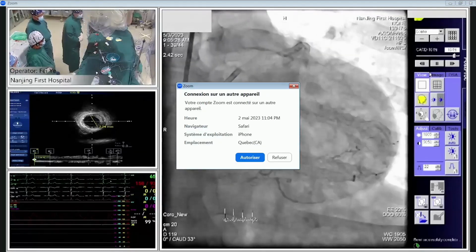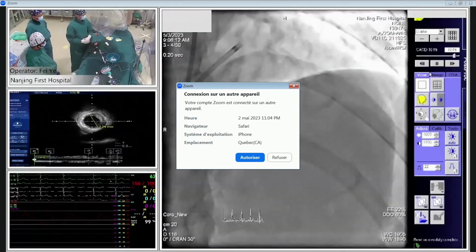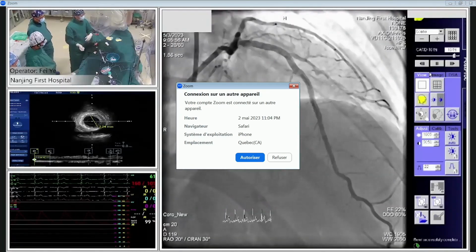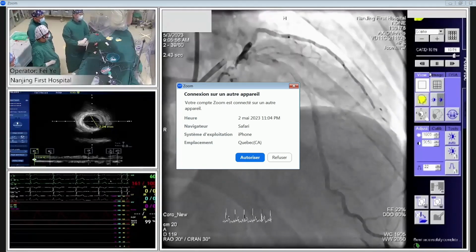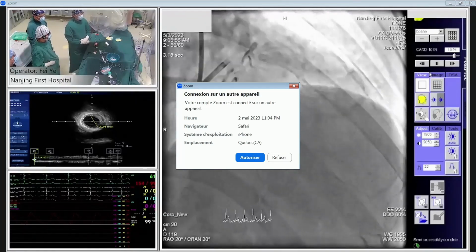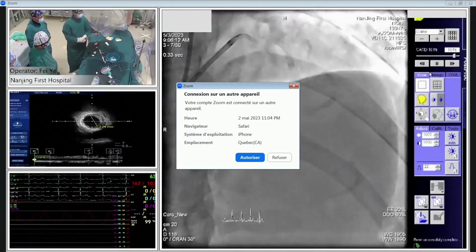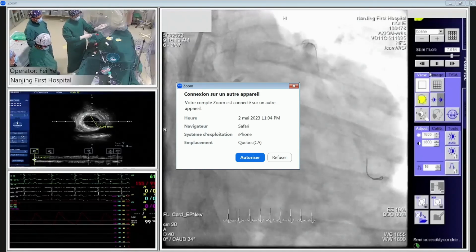And so next view, we want to check every view of the distal part of the circumflex. So from the previous one. Yes, even though we want to see it clearly, we cannot get a very high quality view of the distal part of the CTO lesion here. Then we just perform PCI with a first wire. We want to use a hydrophilic wire with XD, with microcatheter exchange. So no, previous one. Yeah.